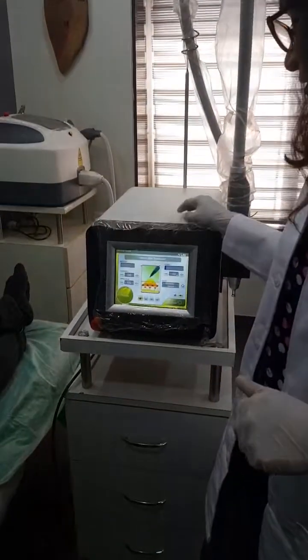Hello everyone, I am Dr. Ashwini, founder of Dermatouch Skin Laser Hair Clinic and owner of Dermatouch Skin Care Brands. Today I am here to show you a procedure called Tattoo Removal with our laser machine. The name of the machine is Q-Switch.